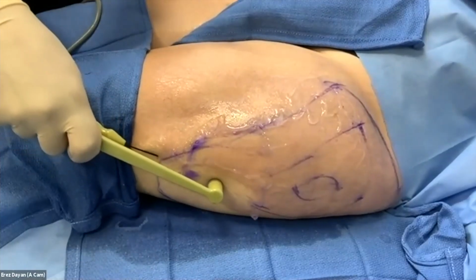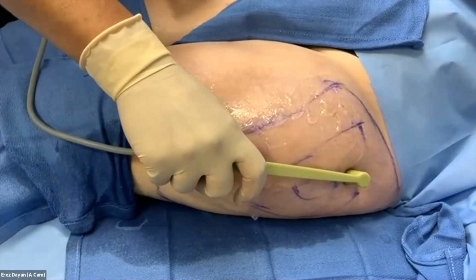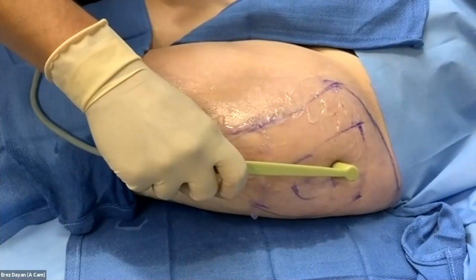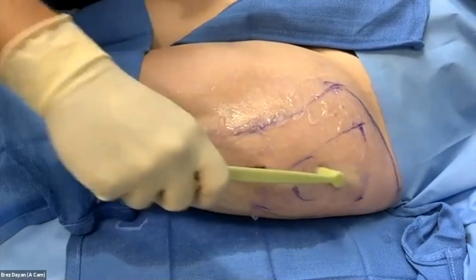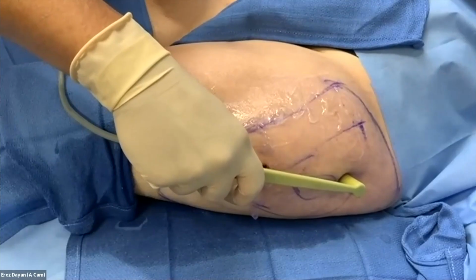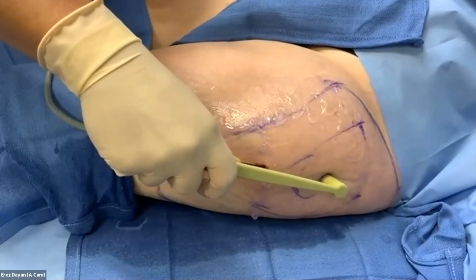And on our end, I don't know if you guys can hear the crackling, but we hear some crackling underneath. Thermage, which was the first radio frequency device for aesthetics, used in 2002, 2003, is monopolar. They really measure surface temperature more than internal temperature, and I think internal temperature probably matters more. We're really trying to affect the fibroseptal networks here. The other thing is, this doesn't really give you a lift, kind of like how filler doesn't really give you a lift. It just contracts kind of globally, and I think that's an important point.